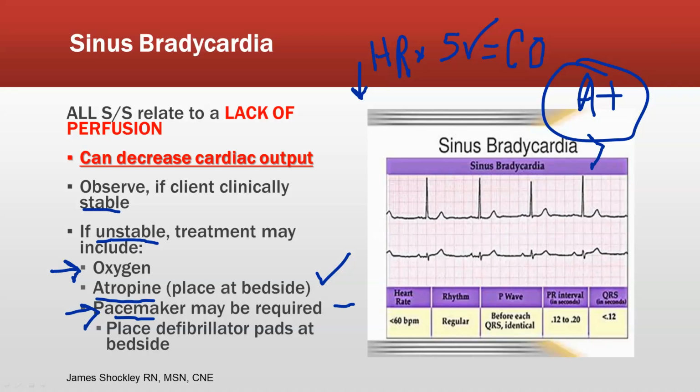I want to make sure that that pacemaker is going to do its job, so we're going to look for pacer spikes on the monitor. But since it's going to hurt the client, I want to make sure that we probably have some midazolam and fentanyl on board. If we determine that more aggressive interventions are going to be needed, then you're going to go down for a permanent pacer, right? So permanent pacemaker.